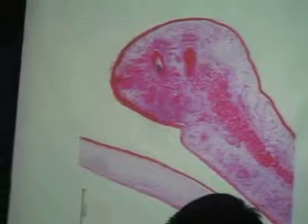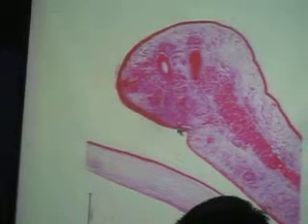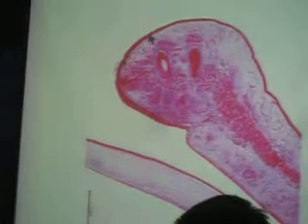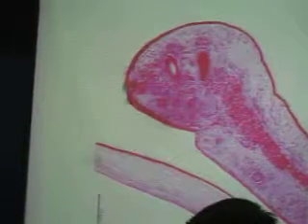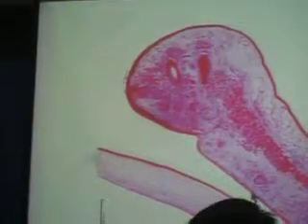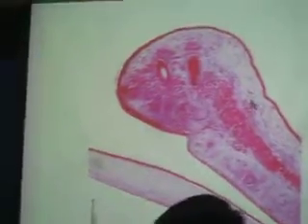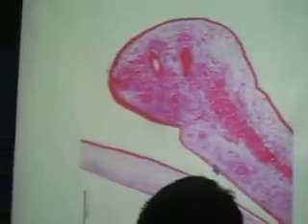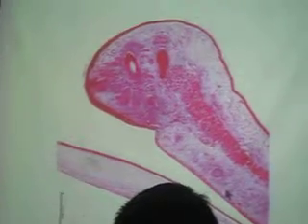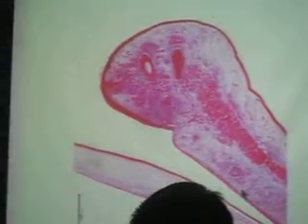But for the inner part of your eyelid, there will be a transition from stratified squamous epithelium, keratinized, to stratified columnar epithelium here, which will be your conjunctiva. So in as much as this part is the inner covering of your eyelid, this is your palpebral conjunctiva. Okay?